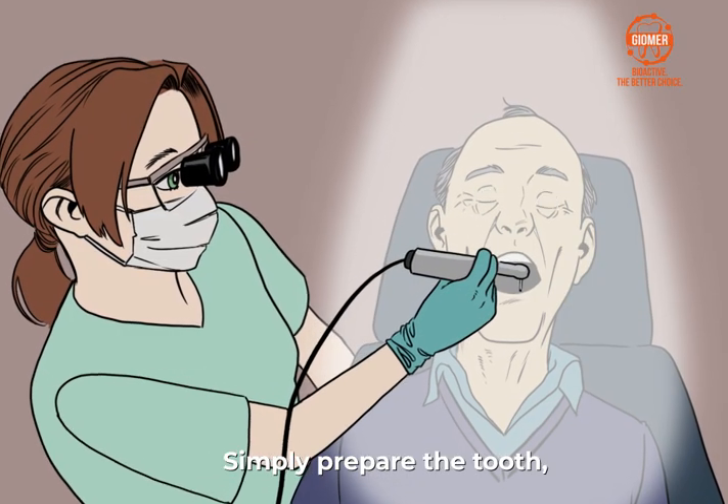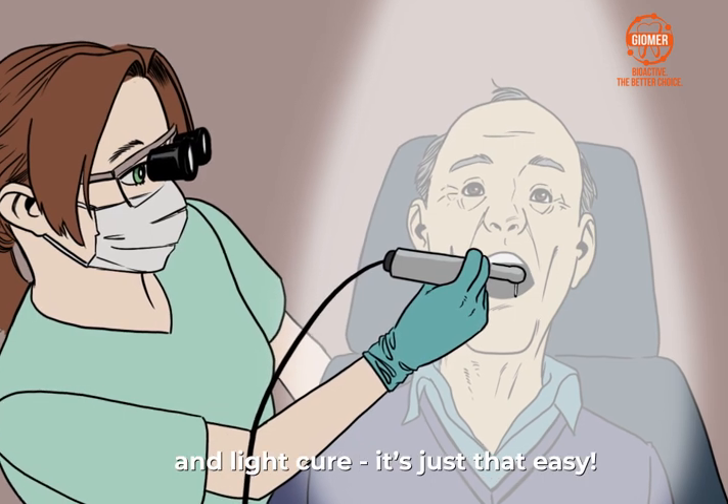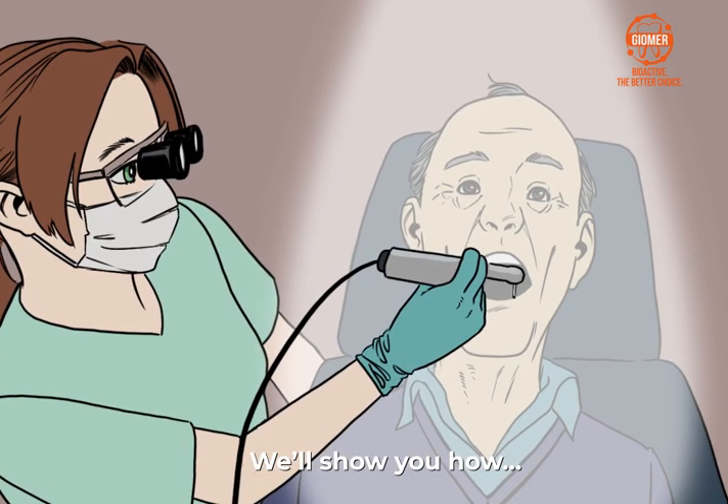Simply prepare the tooth, dispense the FIT-SA into the prep, and light cure. It's just that easy. We'll show you how.